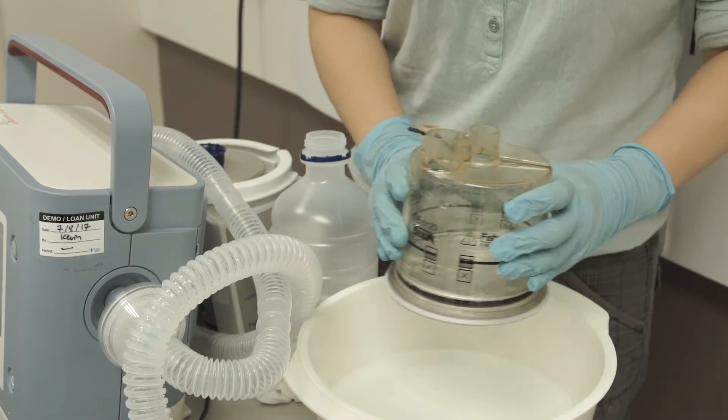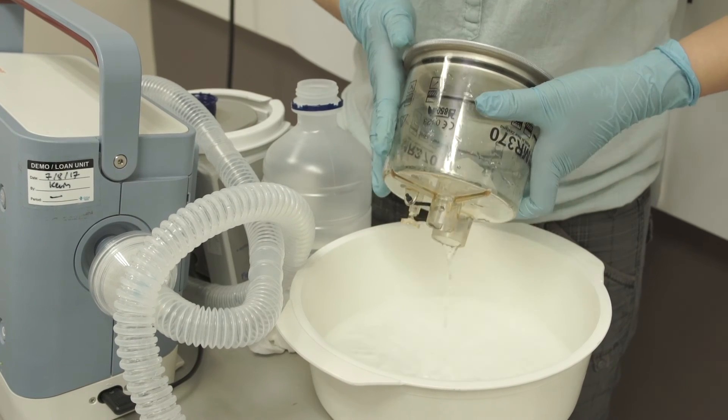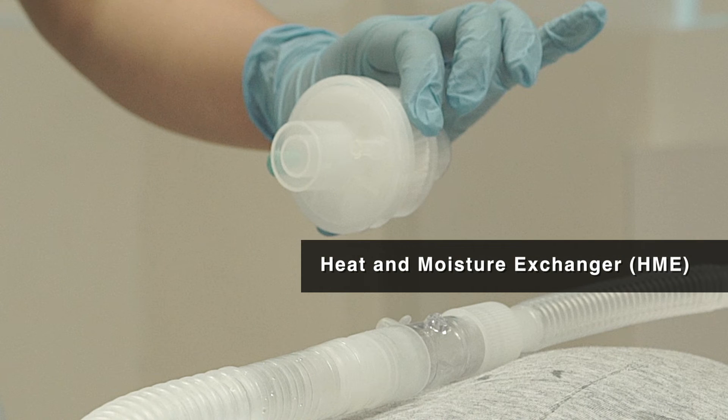Rinse the chamber daily. You may also use HME, or heat and moisture exchanger, for humidification. HME traps the heat and moisture from the exhaled air in the tube so that the inhaled air will bring the heat and moisture back to the patient.